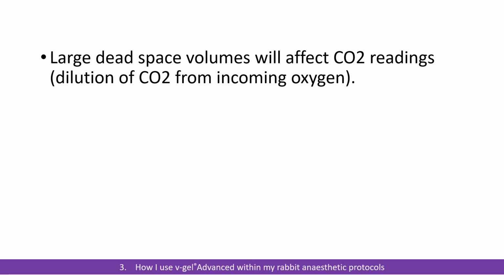If you have a large volume dead space at the front end of the system, that means that incoming oxygen is going to dilute your CO2. So the CO2 reading that the machine is giving you is going to be less than the actual CO2 that the patient is breathing out.